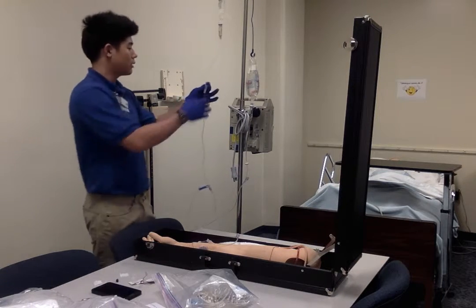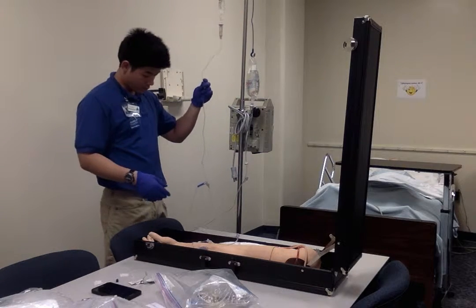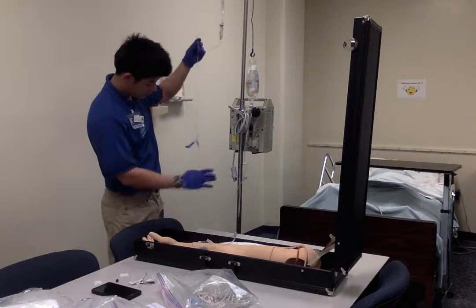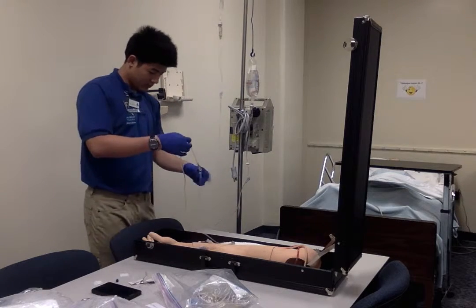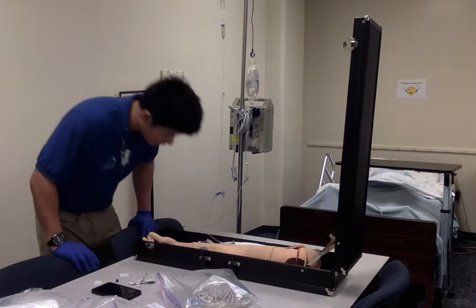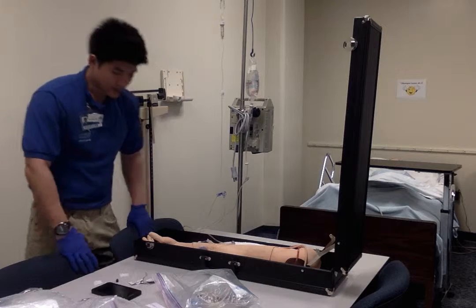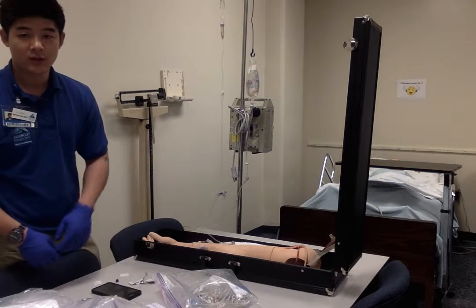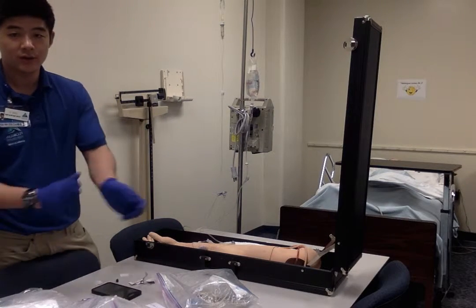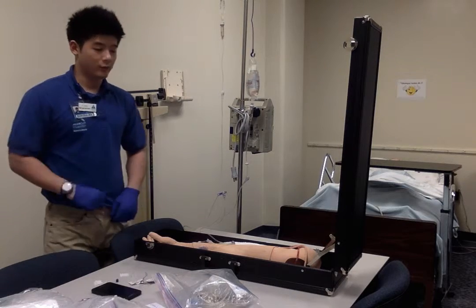1 drop per minute. And let's say I am doing that right now. 1 drop per minute. Medication is flowing. And I'm going to go ahead and check for any distension. Okay, I don't see it. Alright, so I'm going to wait till the medication is done, take my gloves off, do my hand hygiene, and then leave the room. I'm going to come back.